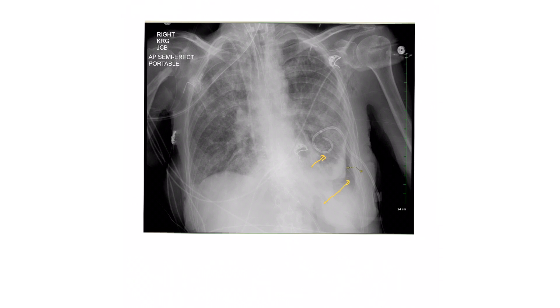This pigtail was inserted for a pleural effusion or pneumothorax, although I can see some residual pneumothorax here — we're not here to discuss why it hasn't fully resolved. The ET tube is here, the carina is here, the NG tube is below the diaphragm, and there appears to be a permacath tunneled under the skin — although it looks a bit too deep and should be positioned slightly higher. These are difficult to reposition because they're tunneled catheters.